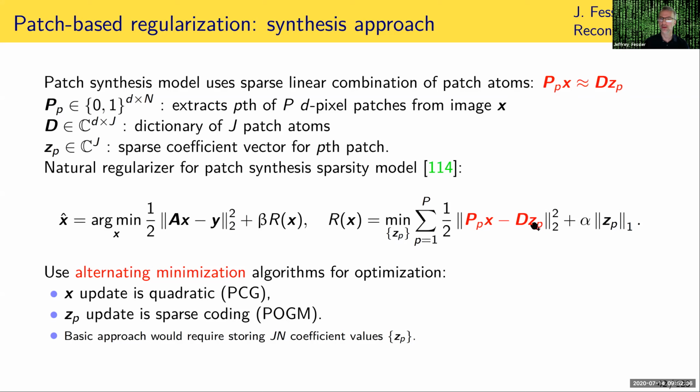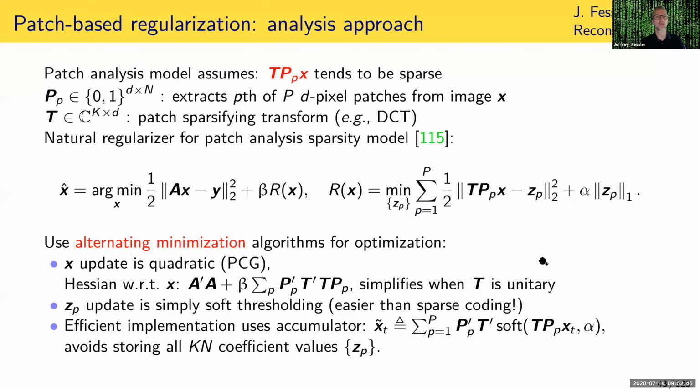You could also think of it as lasso and apply any of your favorite lasso algorithms. But my favorite lasso algorithm is the proximal optimized gradient method. I think I'll skip that detail. Any questions? No. So that's the synthesis approach to patch-based regularization.